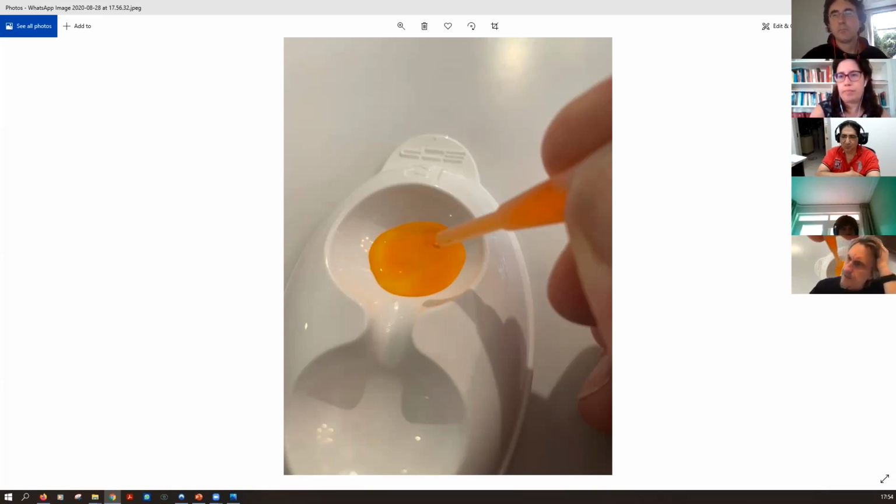We heard some methods of putting half a dozen fluorescein strips into a bottle of anesthetic, and we just thought that's going to be prone to sterility issues. Whereas these minim tips, you can recover and keep ready for the day in the fridge. And when a patient comes in wanting ESP, then drop, and you're using the same as you used on the previous patient. So it's consistency, and the software advances to me have just, as Tom said, gone leaps and bounds. I think it's amazing now. The problem was getting the consistency and the regularity of the fluorescein mix, and this just addresses it and works superbly for us.